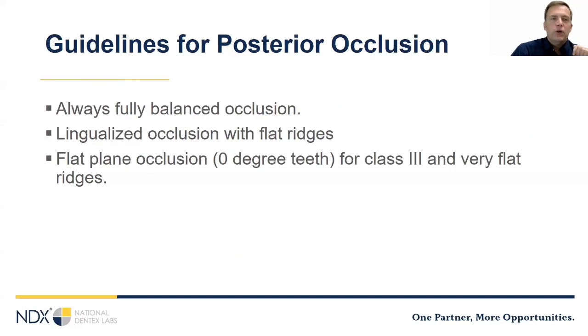So I'm using balanced occlusion here in a different way than I was previously. What I mean in this case is we want to make sure that as the dentures are moving, we're having contact on a tripod, posterior and anterior, so that we're not generating tipping force in any reasonable movement that the person's doing. If your patients have flat ridges, again, we'll want to use lingualized occlusion and also flat plane for class 3 patients.